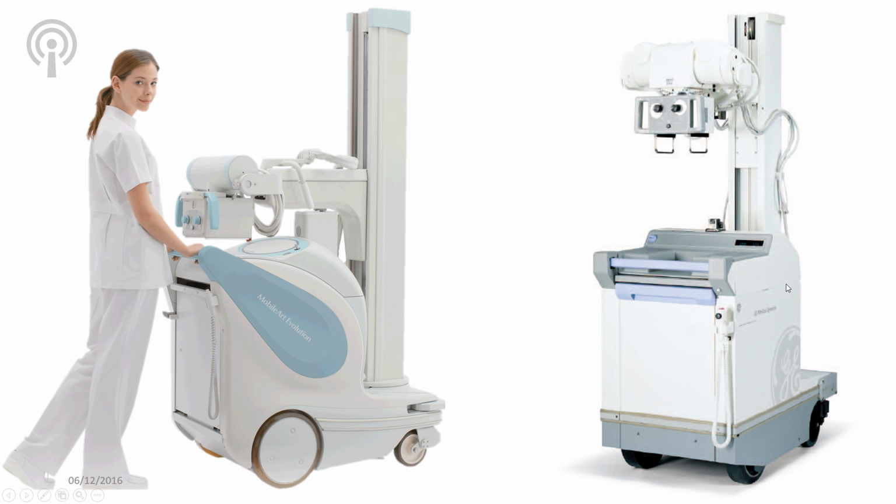It's the AMX4 Plus. They contain lead-acid batteries. This one has lithium in it. This has lead-acid batteries in it, and it will probably still be around when the bombs fall and everything's flattened to dust. This will still remain because they are built like tanks. They weigh about as much as a tank, and this will take a door off or take a lift out before anything. It'll probably go through a wall, because the motors and the way that this is built inside is an absolute monster.